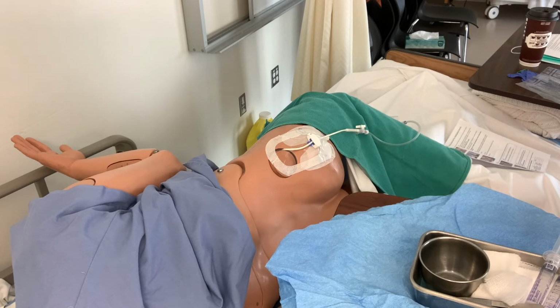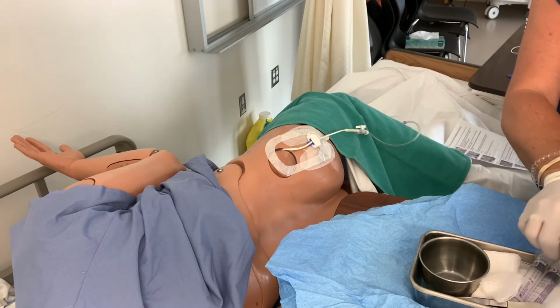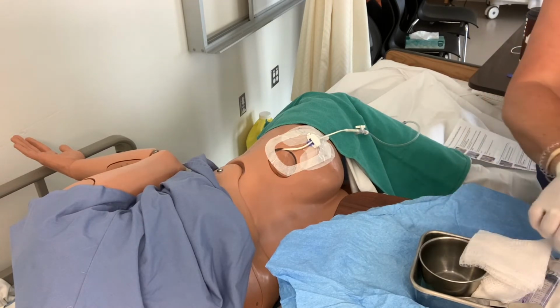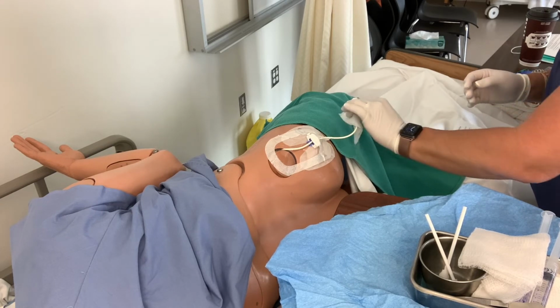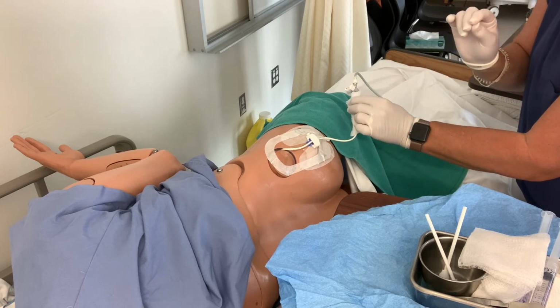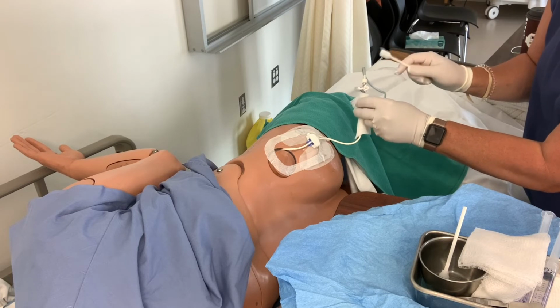Okay, so I've got my gloves on here, and I'm ready to go, but we never ever touch the tube. Okay, so that's the key. That's why I'm wearing sterile gloves. So I'm going to pick out a couple of 4x4s, and what I'm going to do is take my chlorhexidine swabs where I can get at them, and I'm basically going to take the 4x4 gauze and hold the tube. Okay, so remember the tube is dirty, and I want to stay sterile as I can. And I'm going to take this chlorhexidine swab stick, and I'm going to clean the disconnection port of where I'm going to disconnect the tube so that I can actually do the flush.